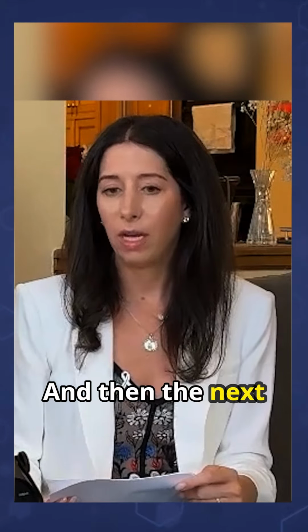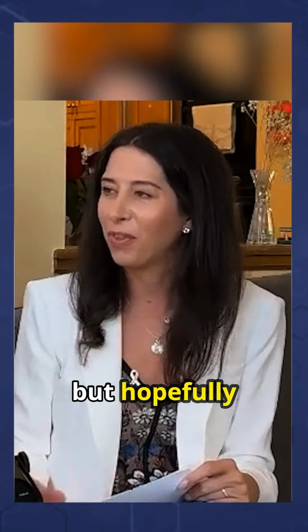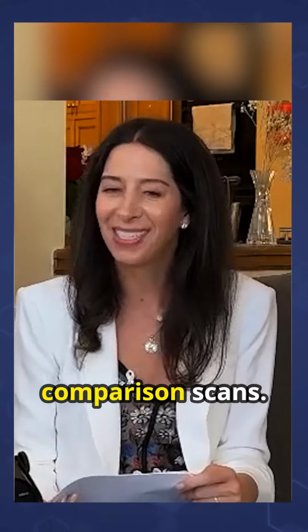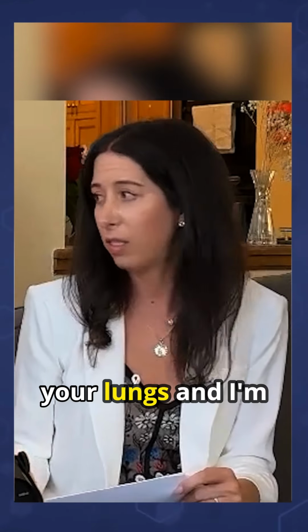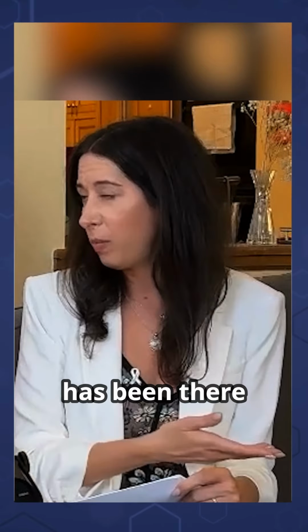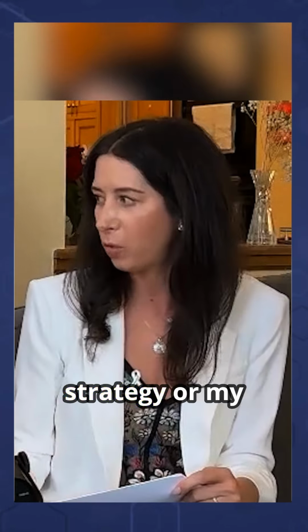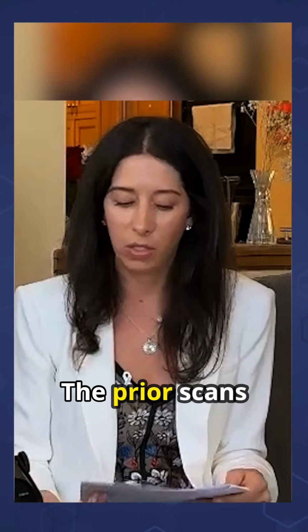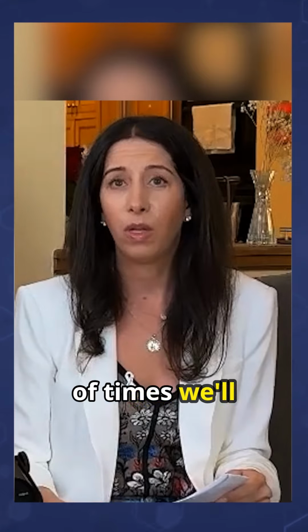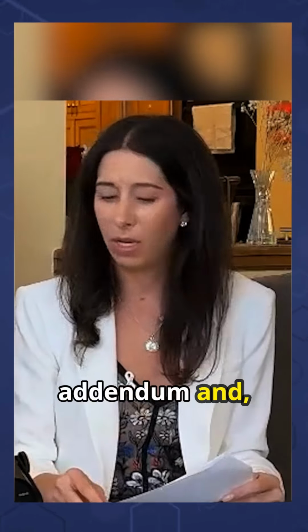And then the next section would be comparison. So radiologist's best friend, but hopefully not their only friend, would be comparison scans. Prior scans are so important because if I'm looking at your lungs and I'm finding a nodule, maybe that nodule has been there for 2 years or 3 years or even a year, and that will change my management strategy or my recommendations. If you don't have prior scans, that's okay, but prior scans are always really helpful. And a lot of times we'll ask you guys to bring in prior reports and that sort of thing. We can always make an addendum and compare.